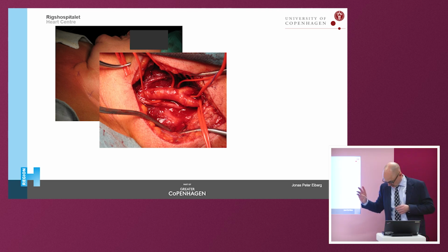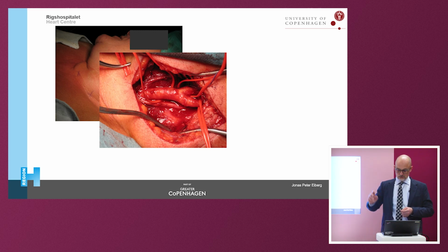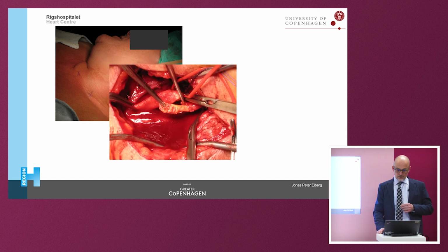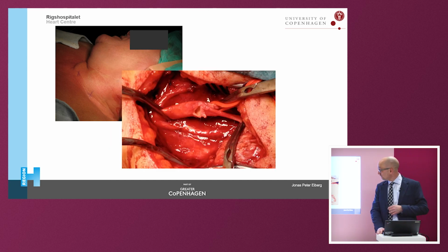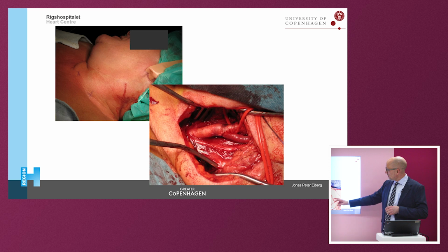You have to believe me when I say this. I think you have to look at it during the procedure before you can be very sure. Normally, I look for the side branch, just to be sure, because I think most necks are a little bit different, and I would say 95% of our procedures is eversion technique, where we cut off the internal and then remove the plaque like this, and then we stitch it on again, and it should look like this, more or less. And you can see this looks a little bit more thin. It is, but it's okay, because the inner part of the vessel is removed.